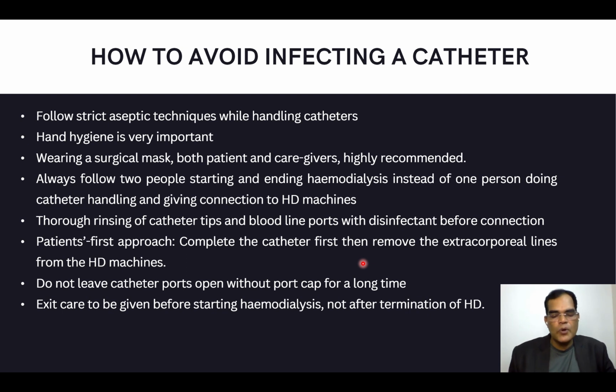And the patient first approach is another way to minimize infection, because most of the time, once dialysis is over, after returning blood, people remove the bloodline from the catheter, take it out from the machine, and focus more on the extracorporeal set removal rather than the catheter, and the catheter will be exposed and open for a longer time. So first we need to take care of the catheter. That's a patient first approach.